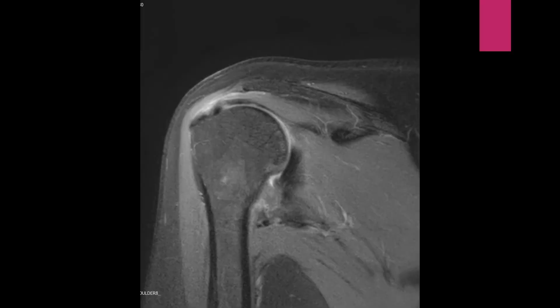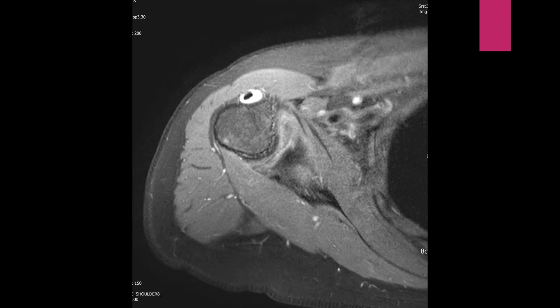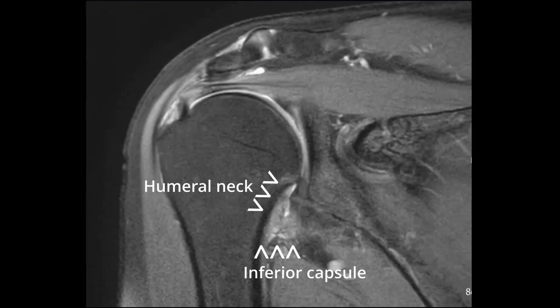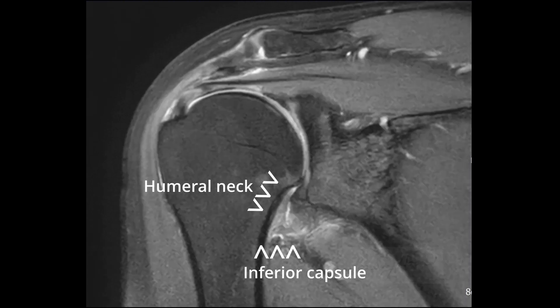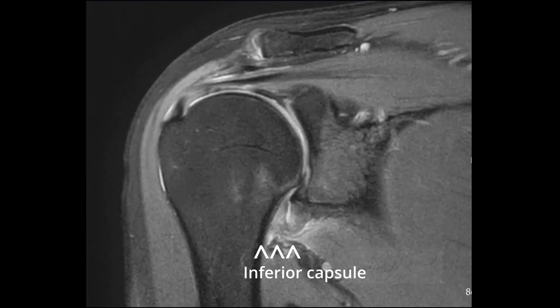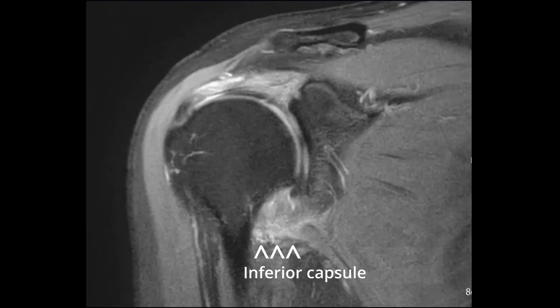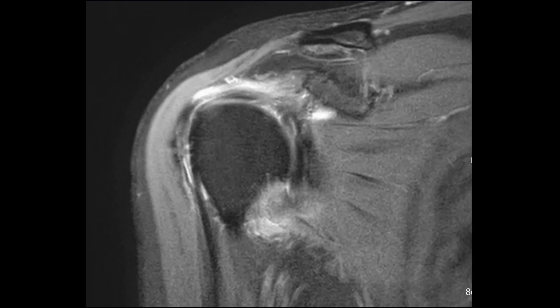Next, I'll show you the coronal view of the pathological inferior capsule. Do you notice any differences? Correct — the inferior capsule appears thicker and seems to attach more broadly across the areas of the anatomical and surgical necks. Now let's observe the axial view of the same area. The large, thick area is positioned on the anteromedial aspect of the humerus neck. It is easy to understand the pathology on the coronal image, but for interventional practice, you must be familiar with the axial and sagittal images.